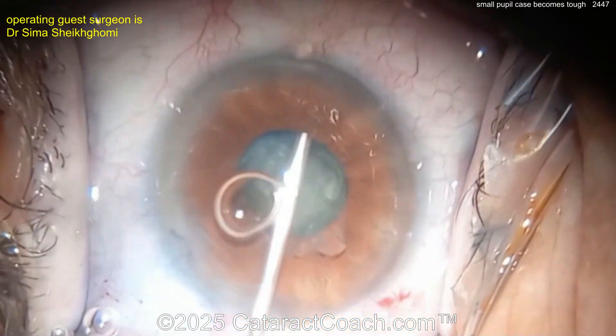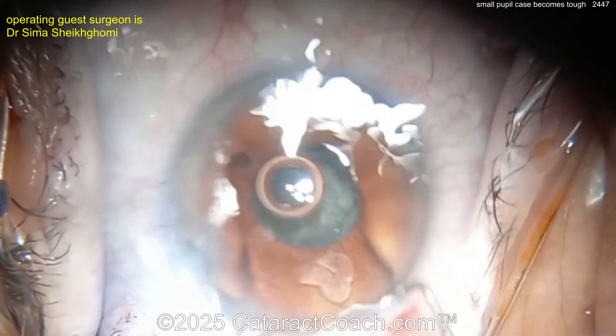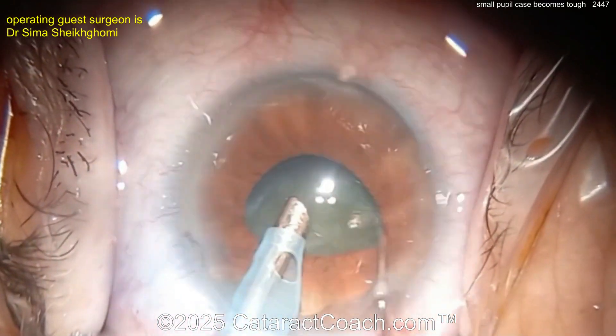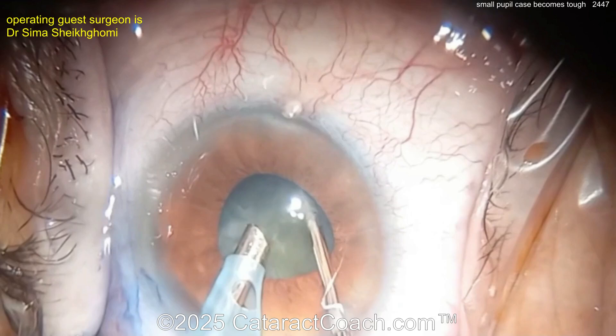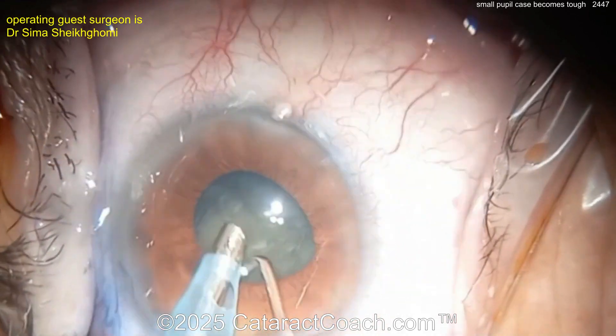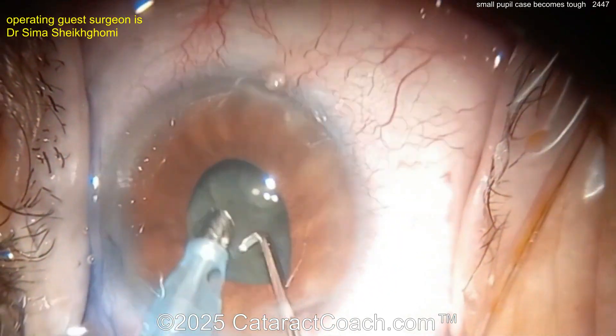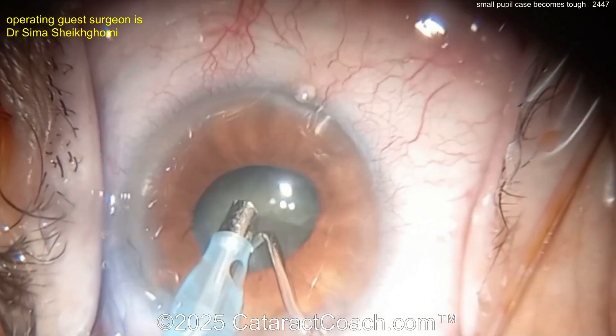In a case like this you've got to ask yourself: do you really want to suffer? Going in with the phaco probe and chopper now. The pupil did expand a little bit more. The surgeon is obviously very skilled — nice technique, rotating it around — but look at the floppiness of the iris. This may be a floppy iris case.